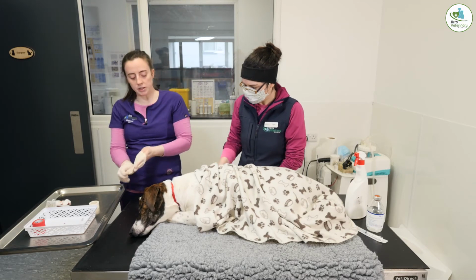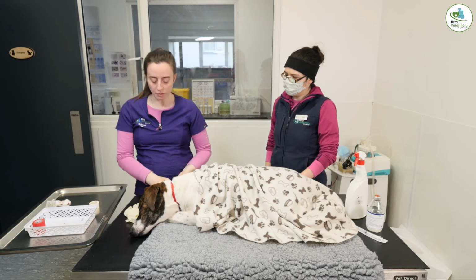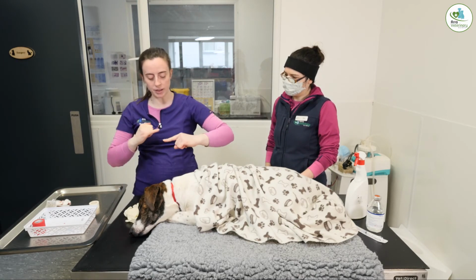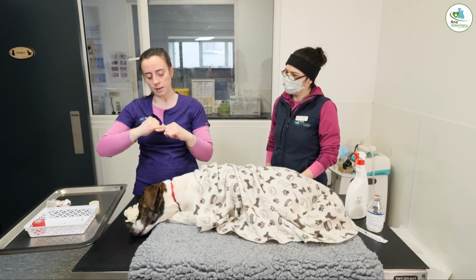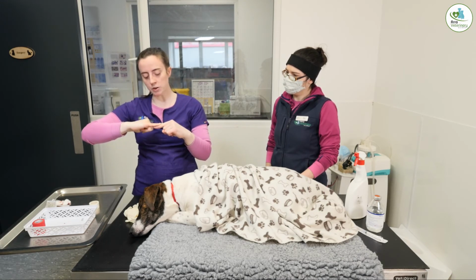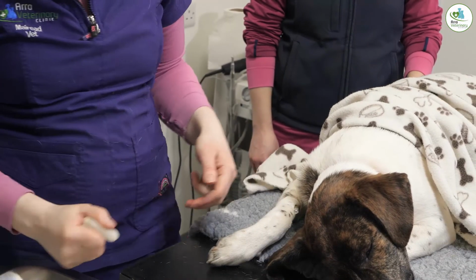So in that video there, we got a flashback and we advanced it a tiny bit, but the flashback stopped. And the reason for that is if you think of it as a tube, what had happened was the cannula had hit the side a little bit. So by moving it slightly out, we got a flashback again and we redirected it straight in. So that's why the flashback stopped on that one.